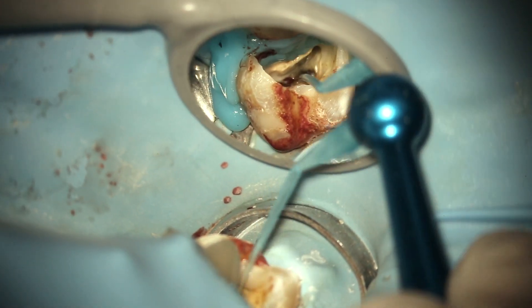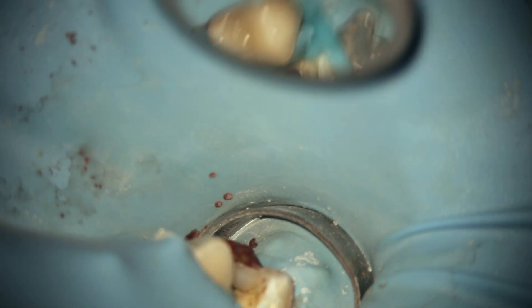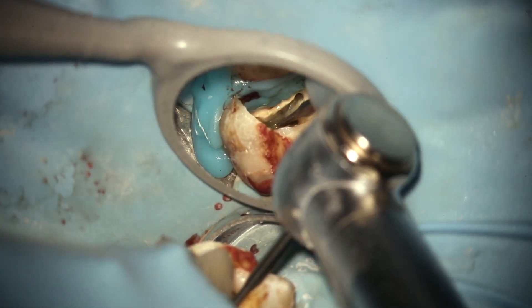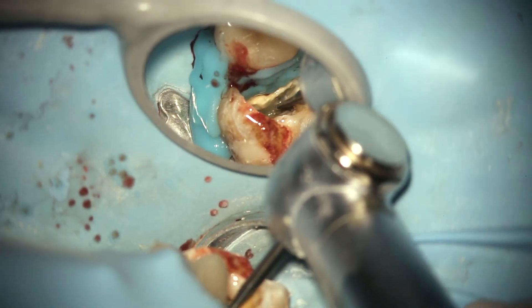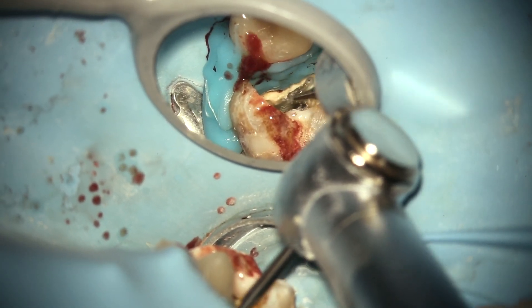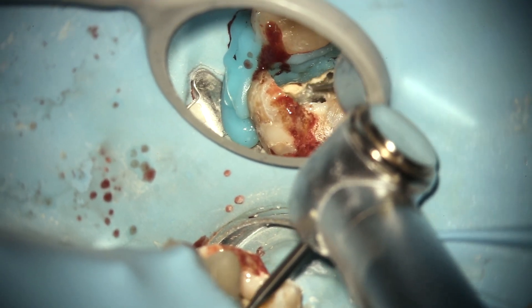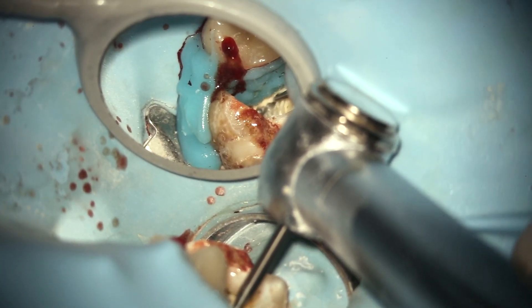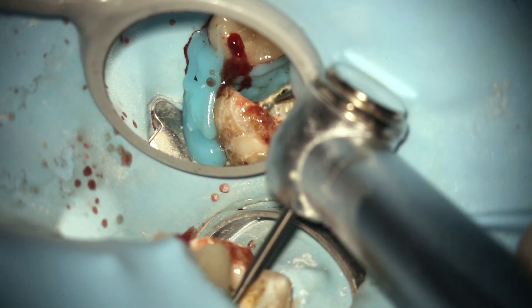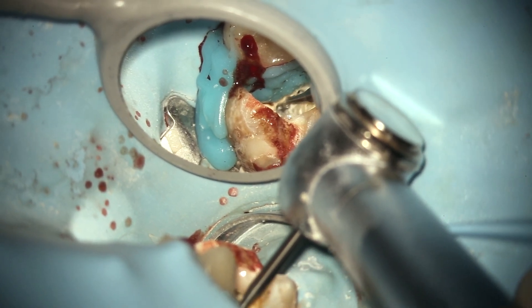There's MB1, DB, palatal — and the MB2 is hiding right there under that wall. I'm going to use a half surgical-length round bur to pull that wall back a little bit, because MB2 is hiding under the MB wall. It's a surgical-length half-round bur at high speed. You have the hand skill, the magnification, and the bright light. I'm just brushing back along the trough from the MB.